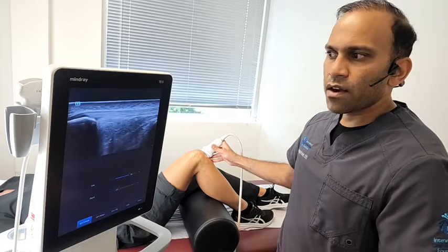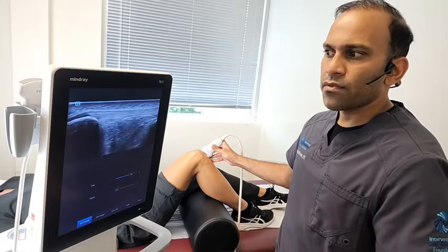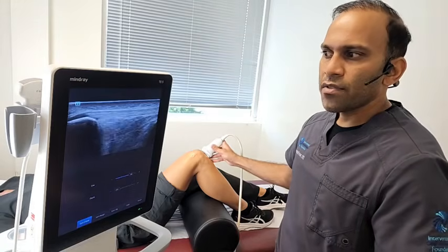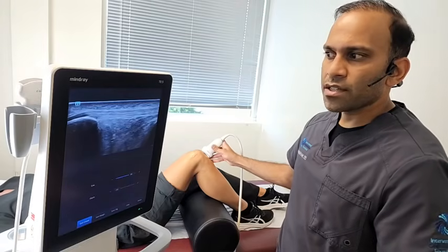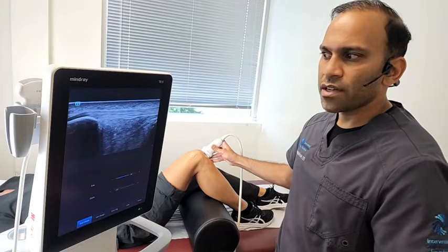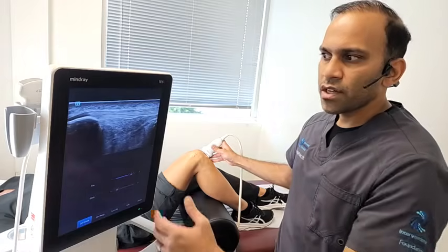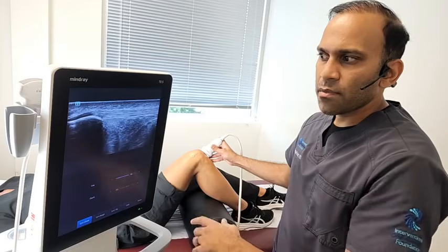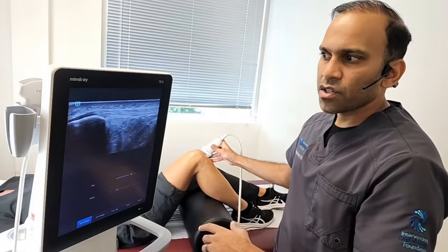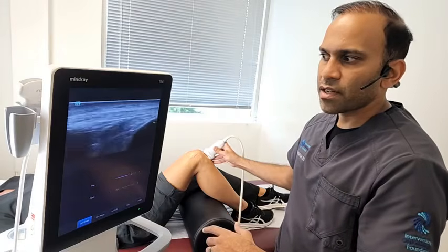If our biomechanics are off, or if we had an injury at any point, then our kneecap can glide improperly in its groove and cause that patellar tendon to start having some disorganization to it. So you can see that there are these thin black lines throughout here. There might be a little bit of disorganization of those fibers of the patellar tendon.